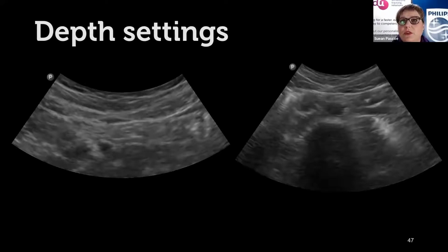The other advantage for doing that, if you run up and down the belly in transverse, if the aorta, as you scan north and south, is dancing all over the screen, it tells me that there's a tortuous aorta. But if it's sticking in the same place and is very consistently sitting on that anterior surface of the vertebral body, then you know that there's not so much tortuosity.